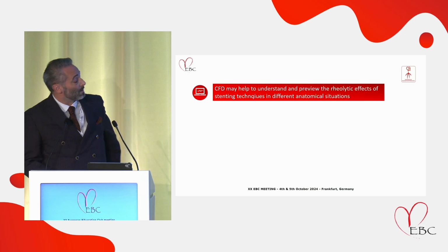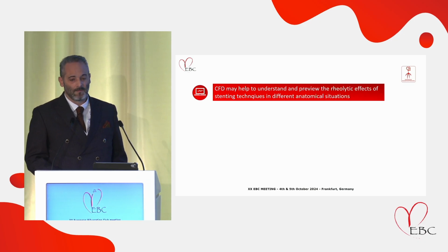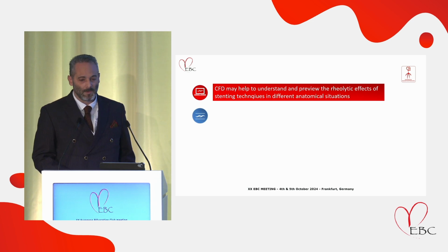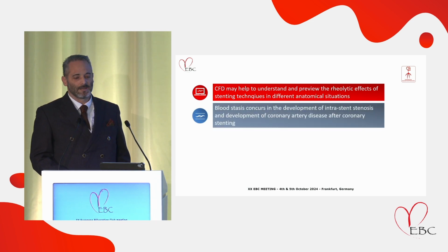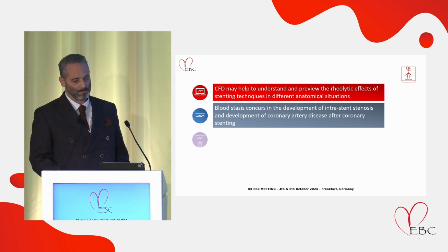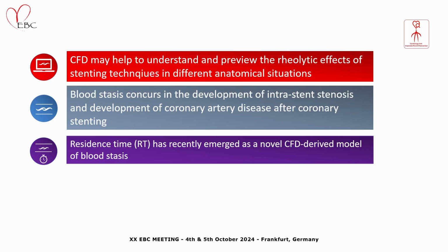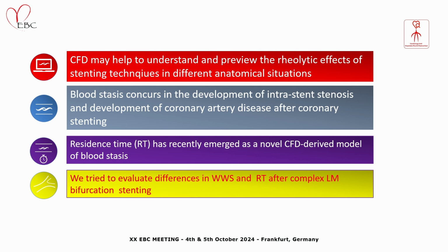We know that computational fluid dynamics may help to understand and preview the rheologic effect of the stenting techniques in different anatomical situations. Flow stasis contributes to the development of intrastent stenosis and coronary artery disease after coronary stenting. Residence time has recently emerged as a novel computational fluid dynamics-derived model of flow stasis. We tried to evaluate differences in wall shear stress and residence time after complex left main bifurcation stenting.